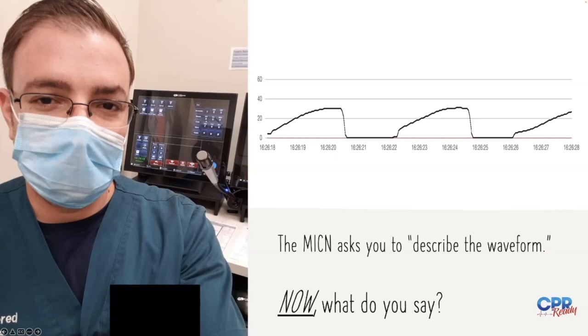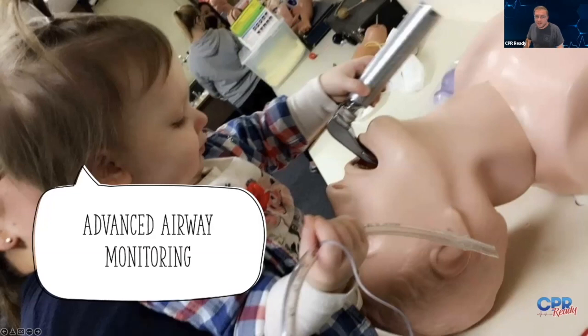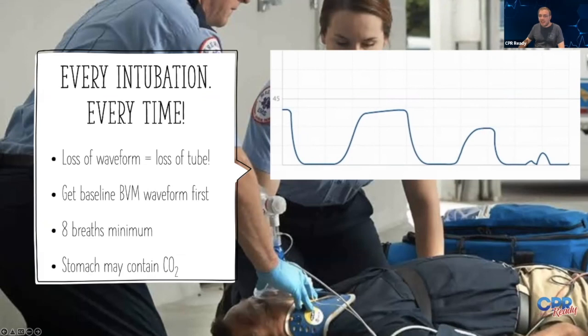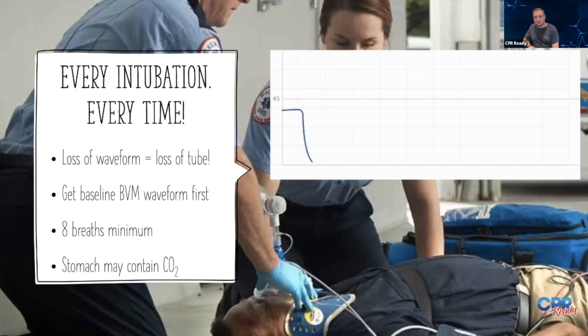So it's not just good or bad or absent or present. Let's talk about some special cases. So we talked about advanced airway monitoring, right? And I just mentioned it again because it is so important. Every intubation, every time, if you have it available to you, and I can't imagine a modern EMS system today that does not have the ability to monitor end-tidal CO2 if they also have the ability to insert advanced airways, they've got to be on some sort of continuous capnography monitoring. You need to be able to see that waveform. It is the gold standard when it comes to advanced airway monitoring.